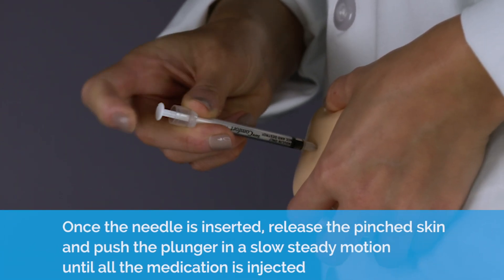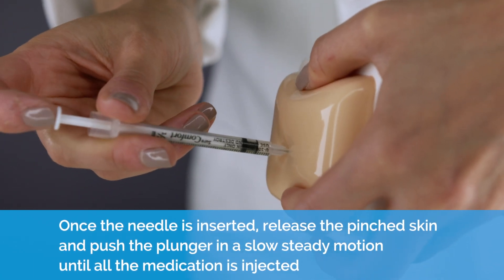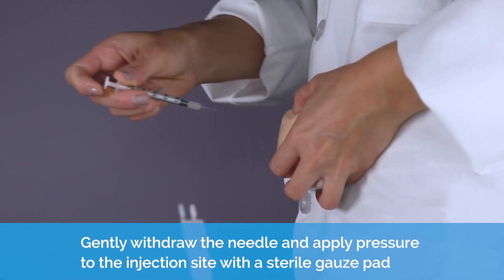Once the needle is inserted, release the pinched skin and push the plunger in a slow, steady motion until all the medication is injected. Gently withdraw the needle and apply pressure to the injection site with a sterile gauze pad.